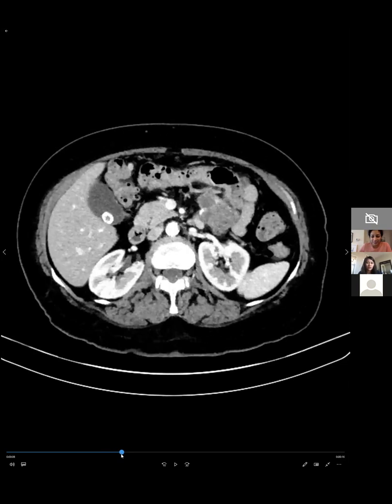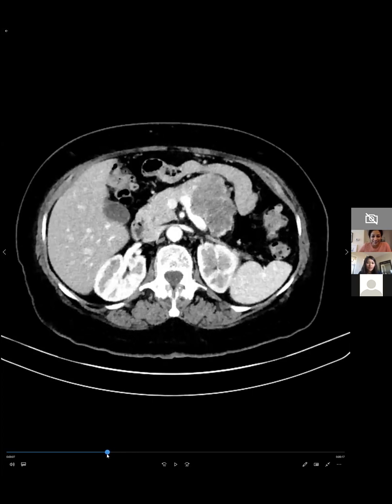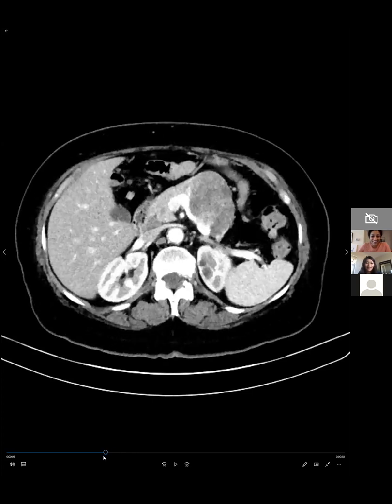Okay, so, Gaurav, Nelly, what do you guys think? I already know the case, so I'm not going to. Well, I was trying to determine if I'm going to a solid versus cystic category here because anytime I've seen a very heterogeneous, quote unquote, solid lesion like this, serous cystadenomas can mimic solid lesions sometimes. But at the same time, I'm looking at this here and it looks like it's potentially invading the splenic vein, so I might not be that certain about this being a serous cystadenoma.